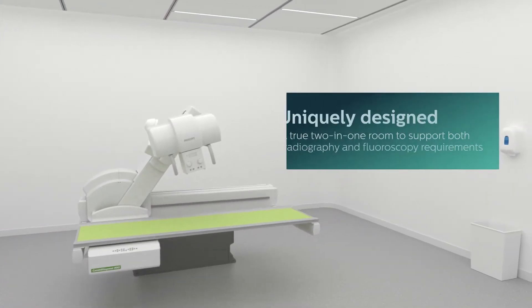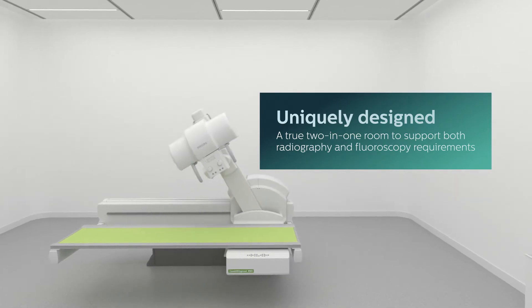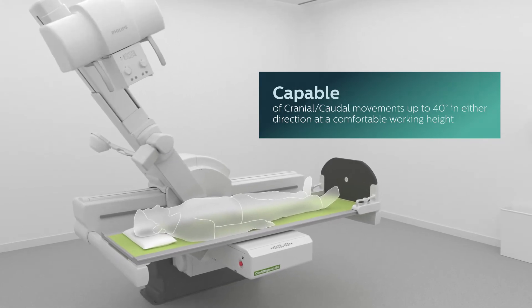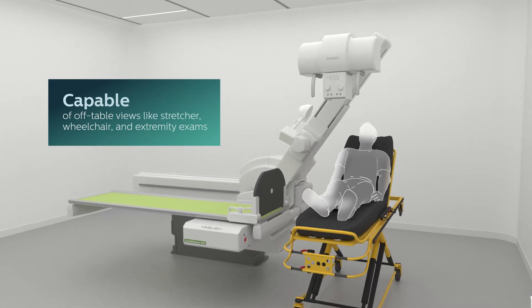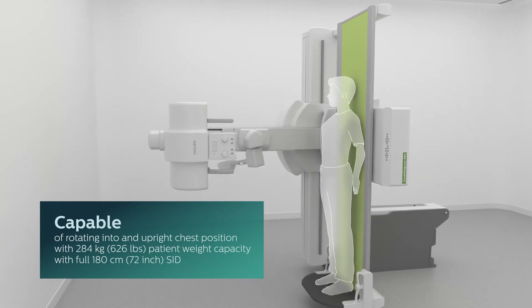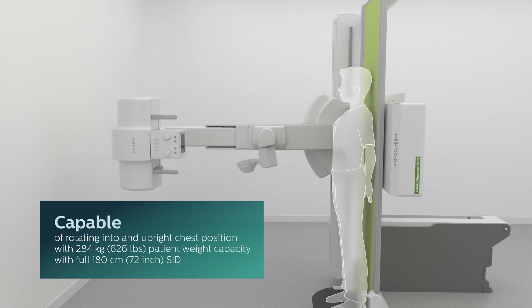Philips CombiDiagnost is a true 2-in-1 system design, capable of achieving many complex radiography and fluoroscopy positions, including cranial or caudal angling for cervical or lumbar spine exams, off-table work to support a stretcher or wheelchair, or extremity exams, upright chest exams with a full 180-centimeter or 72-inch SID, and long-length stitching on the table, to name a few.